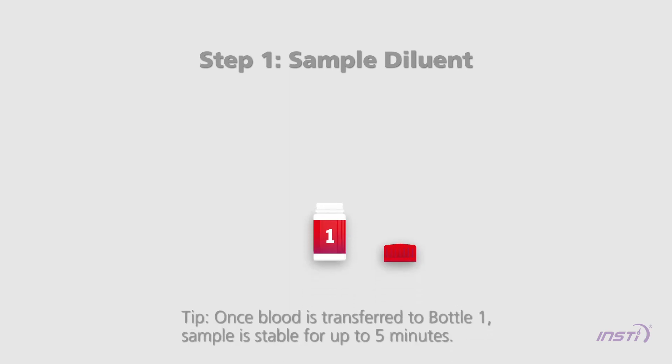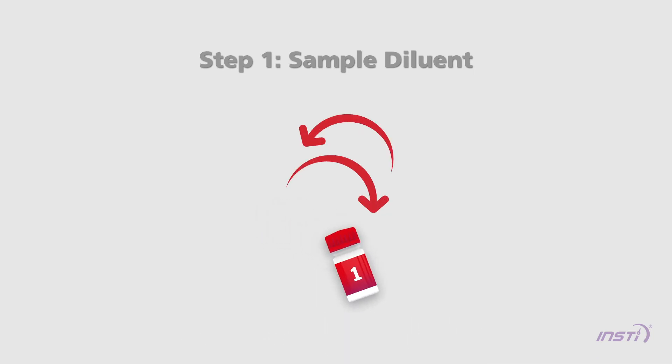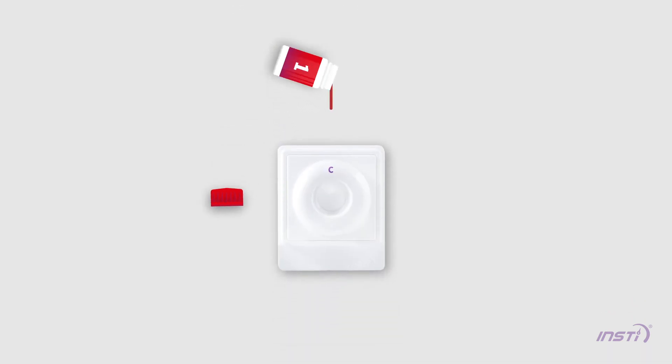Step 1 — Sample diluent. Once the sample has been transferred into Bottle 1, the sample diluent, twist on the cap of Bottle 1 and shake the bottle 4 times. Pour all the liquid into the membrane unit. Wait until the liquid disappears.